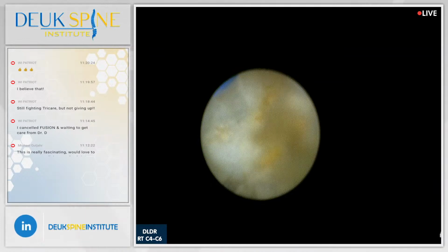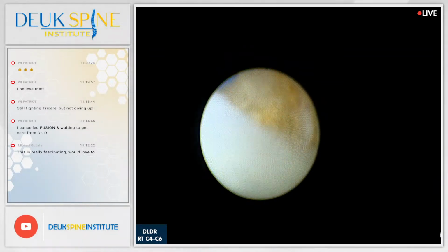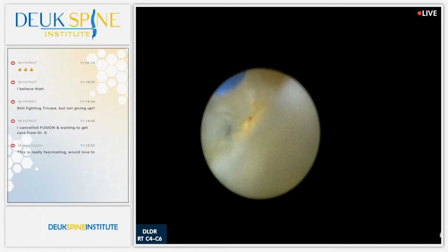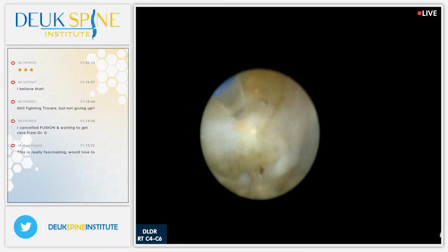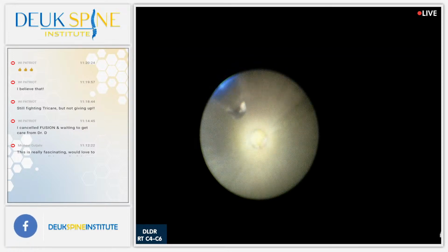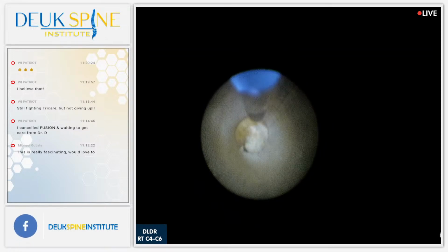This patient came all the way from Hawaii just to have this surgery. This one and the one on his back. And we're just about done. He's gonna go back today to his hotel and he's not gonna have this pain anymore.